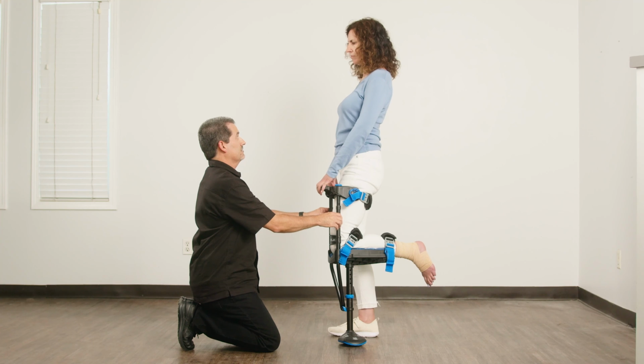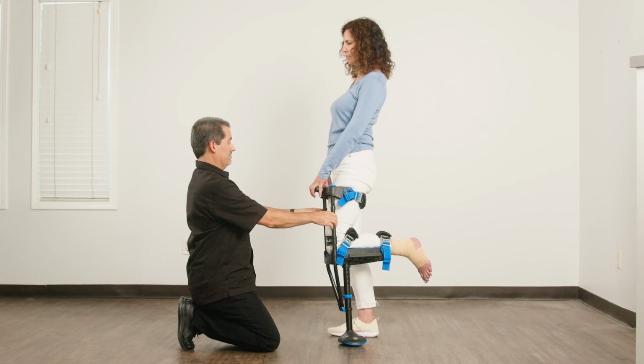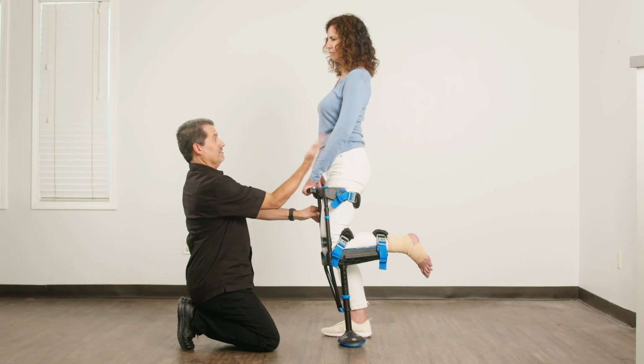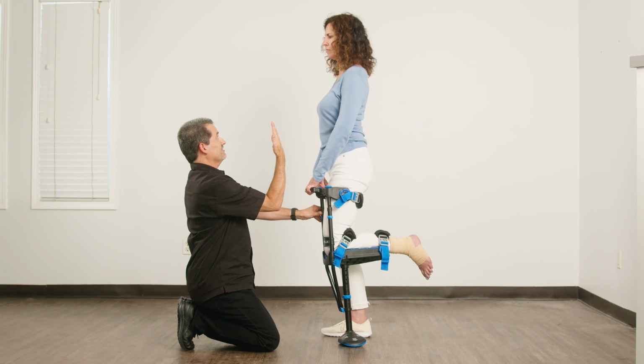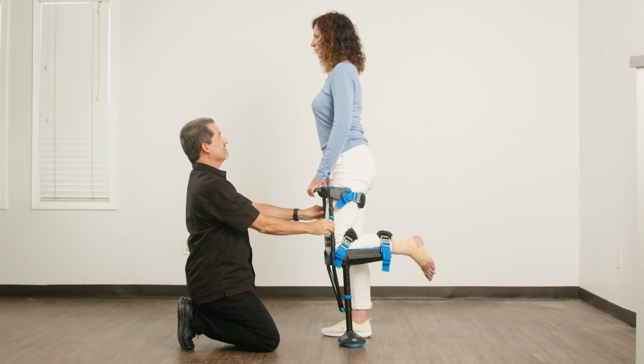Some patients will resist leaning forward. Some will even lean back. This is understandable. It can be scary to commit to their first step. It's essential that you correct this right away. If the body mass does not advance in front of the iWALK foot, then the patient can't walk. Plus, there's the risk of them falling backwards.